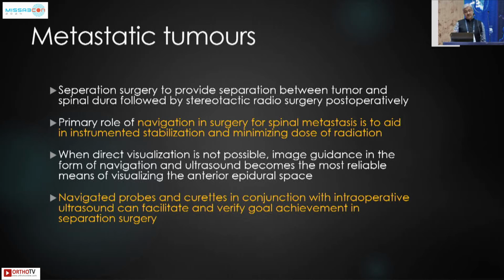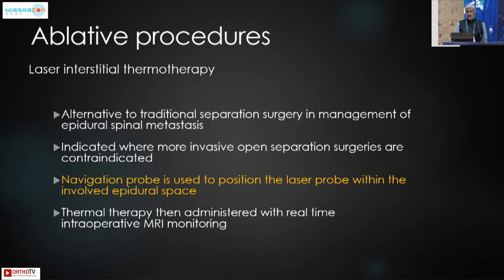It also has use in metastatic tumors where the navigated probes and curettes, in conjunction with intraoperative ultrasound, can facilitate and verify goal achievement in separation surgeries. And when direct visualization is not possible, image guidance in the form of navigation and ultrasound becomes the most reliable means of visualizing the anterior epidural space.